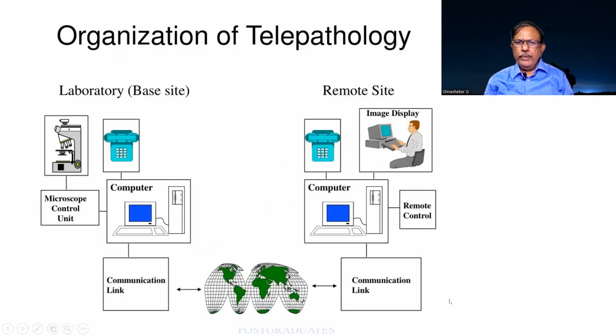So this is a good picture, which I would like you people to remember. This is the basic site, maybe our laboratory, from which I am taking a picture, and it is fed onto a computer. There is a computer link or a satellite link through which it goes to any other part of the world where they pick up the image. It is fed onto the computer, displayed onto the screen, and then they study it and give a diagnosis.